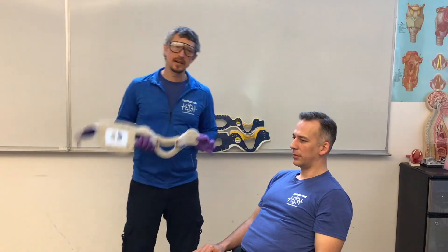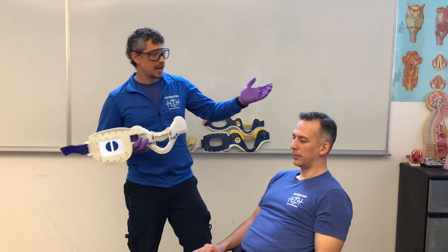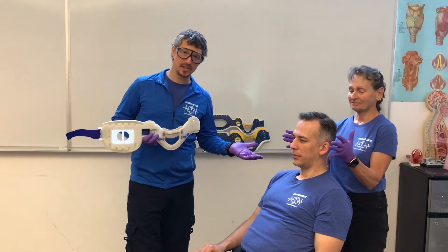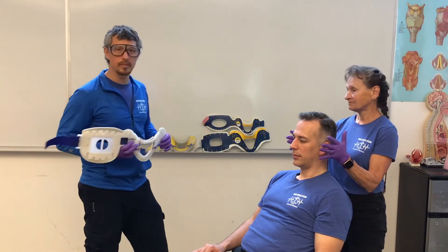My patient Nathan is going to be a candidate for the adult. My assistant Sue, even though she is not a pediatric age, she would be an appropriate candidate for the small adult or pediatric collar.